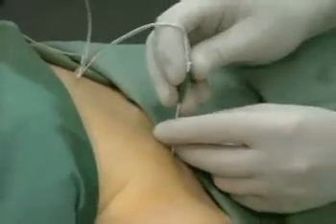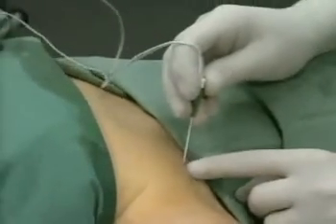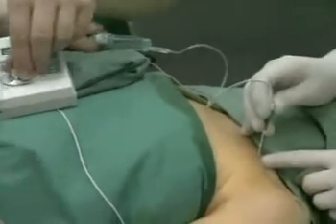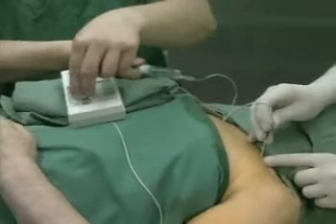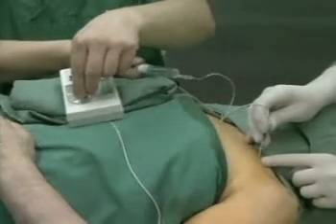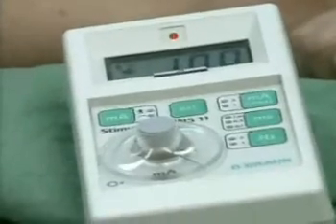The catheter technique is performed using a stimulation needle with a 55 mm Teflon introducer. The stimulation current is set to 1 milliampere with a pulse duration of 0.1 milliseconds.